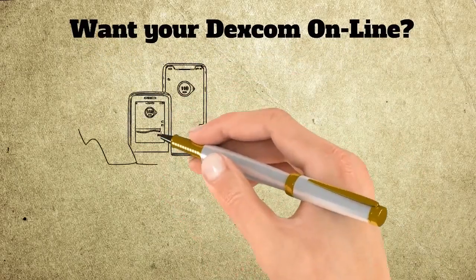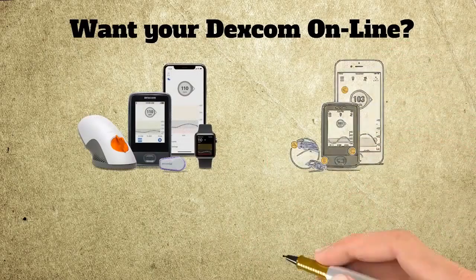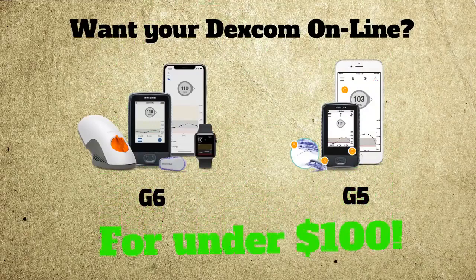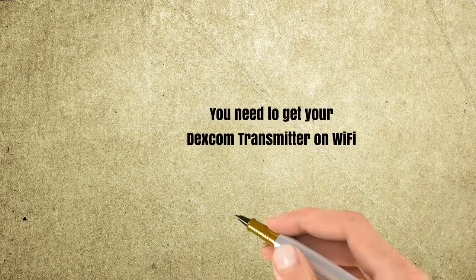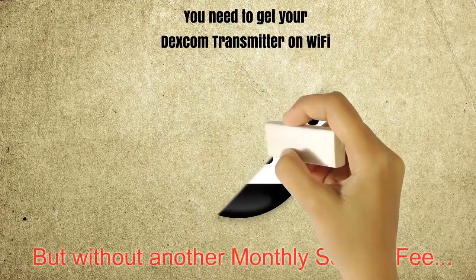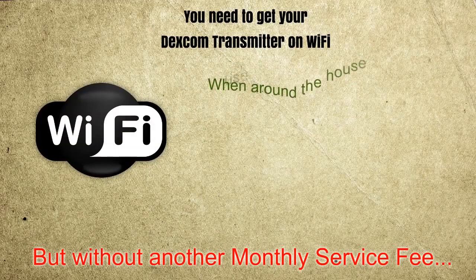Watch this video to get your Dexcom G6 or G5 online. This is great if you have a younger child and don't want to add another cell phone to your monthly plan. To do this, you need to get your transmitter on Wi-Fi to work with the Dexcom apps. You can do this by following this trick and avoid another monthly service fee on your cell phone plan.